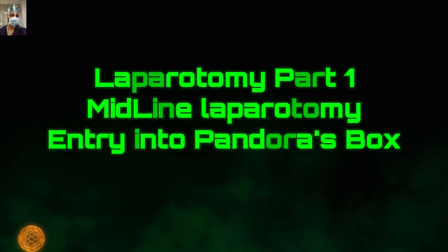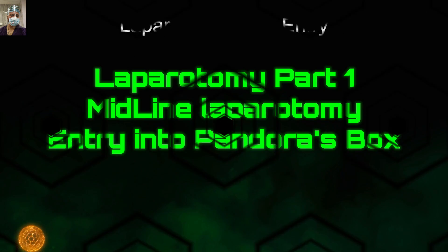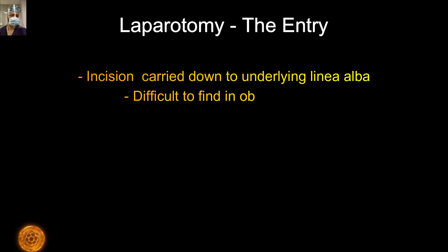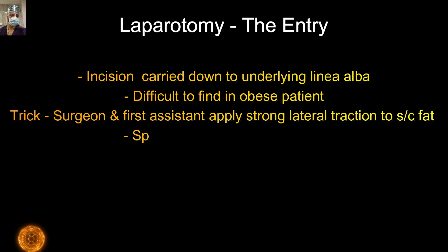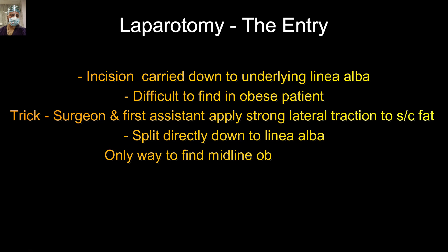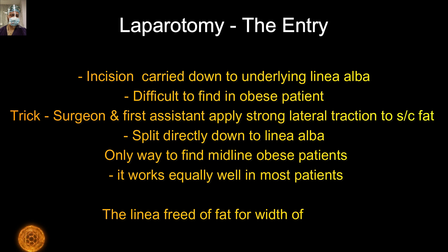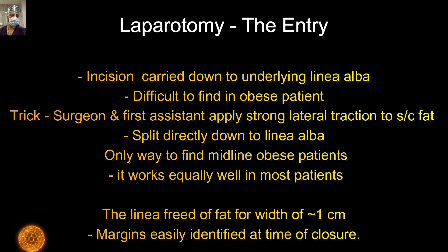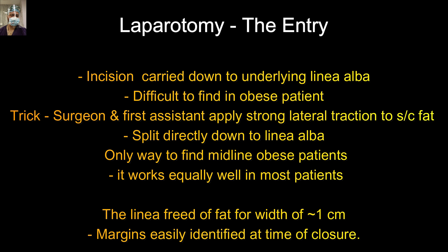We will not go into theoretical discussion as most points have already been covered. This first video demonstrates a midline laparotomy. The incision is carried down to the underlying linea alba. How to find the midline in an obese patient — the surgeon and the first assistant apply strong lateral traction to the subcutaneous fat and you will automatically go to the midline. We free the linea alba on both sides — right and left — up to one to two centimeters, so that we get good margins when closing the laparotomy.